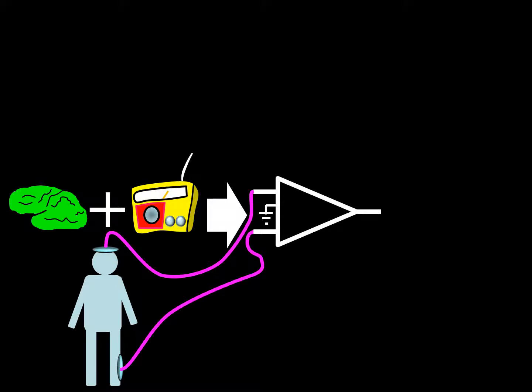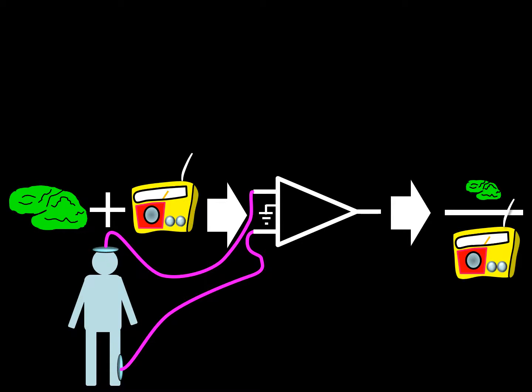Probably one of the first body parts tried was one of the legs. I assume that the early electroencephalographers' reason for choosing the leg was that the cerebral activity in the head and in the leg was obviously different, and noise would be, or so they thought, about the same at both places. But it was not to be so. The noise was too much. They concluded that the EEG epoch collected with the second input attached to one leg was unreadable.